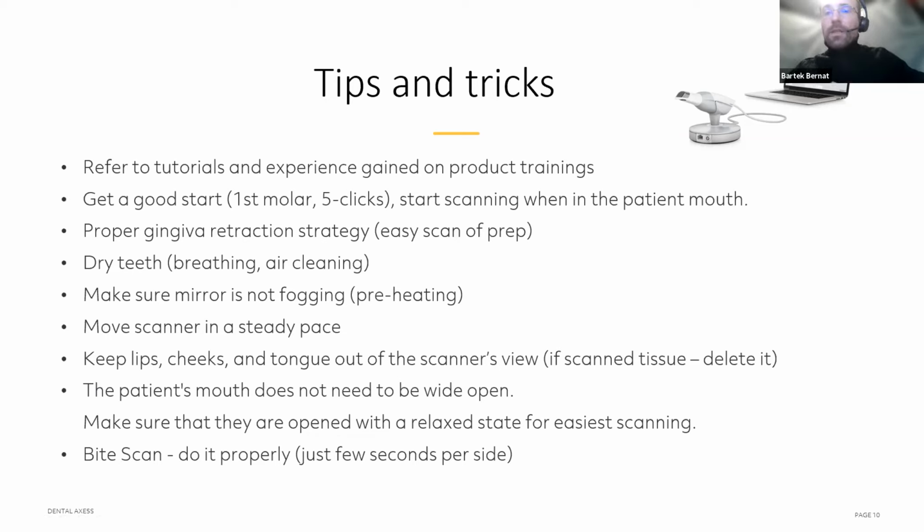It doesn't have to be, because it actually can stretch the lips so far it's going to be impossible to get some incisors area over here. So sometimes it's okay to let the patient actually relax a bit, close a bit for the easier scanning. And the last thing here is a bite scan.